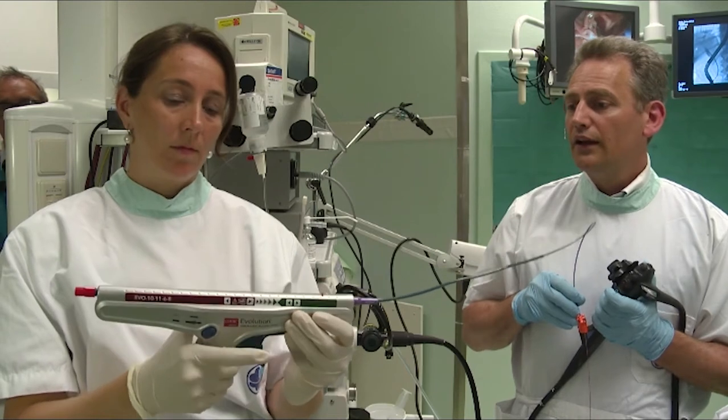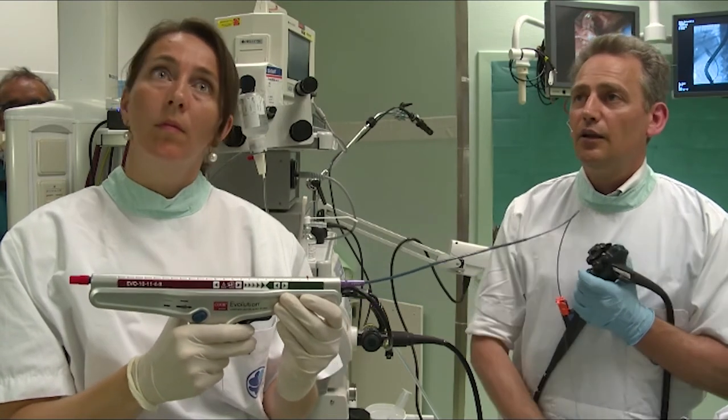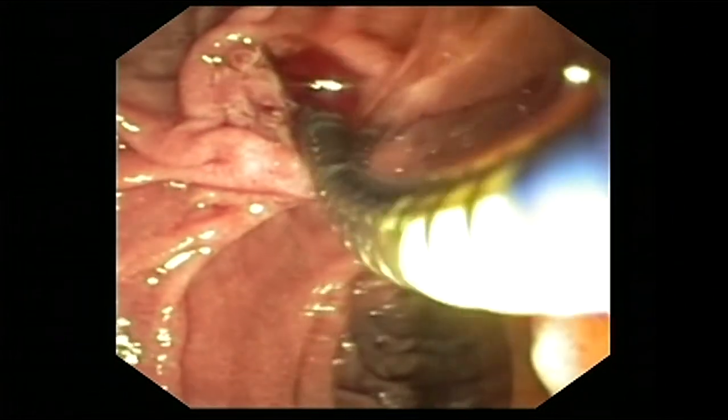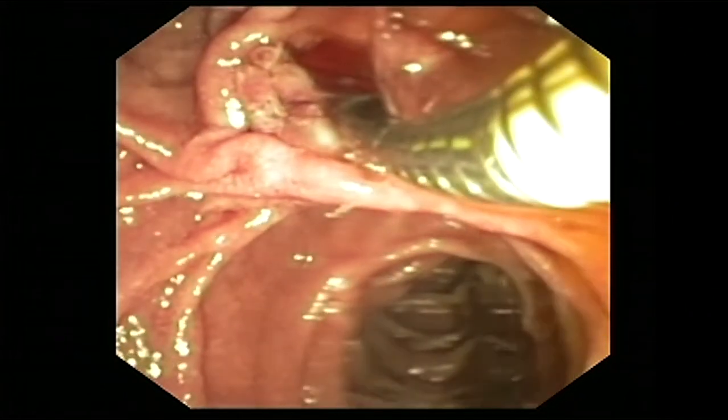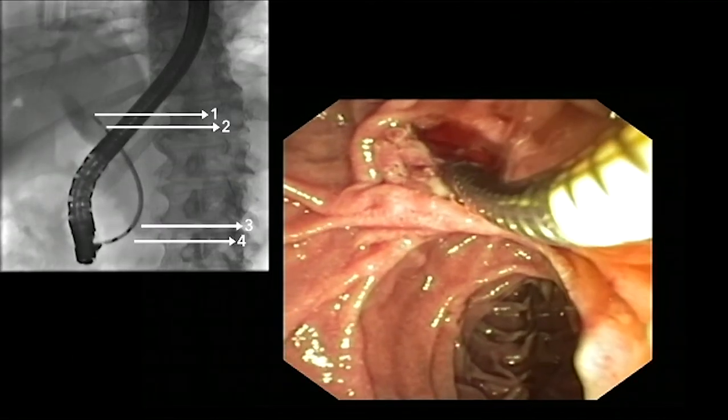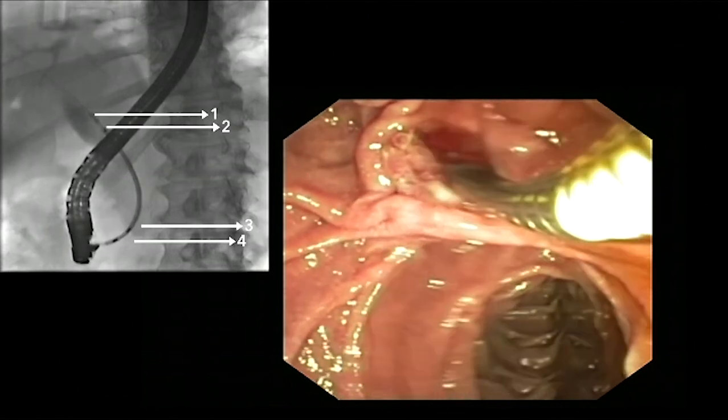We will now again deploy the stent. Again, we control this endoscopically. As you can see, very nicely the yellow marker, and also on the fluoroscopy. I withdraw the stent.